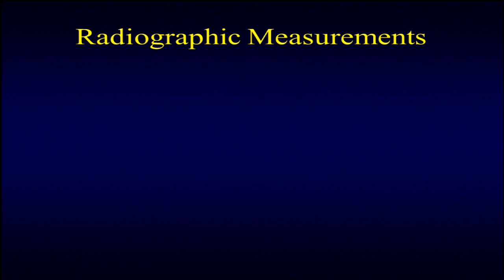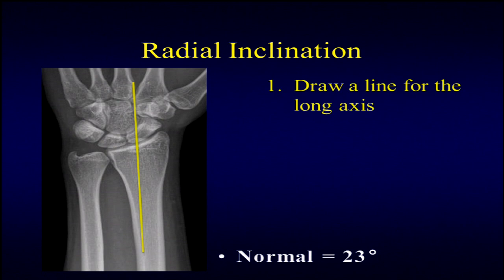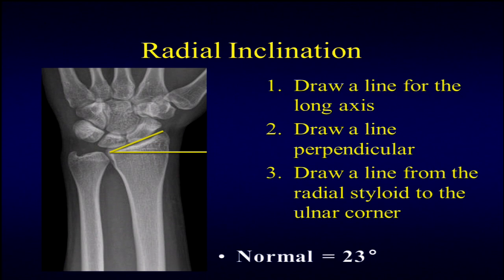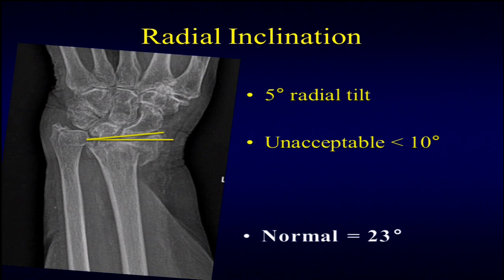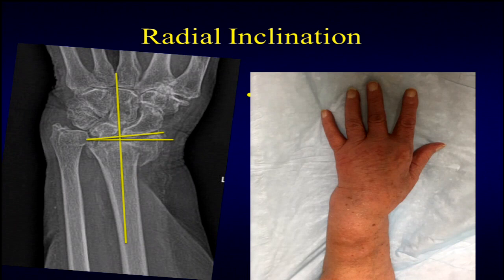Some of the standard radiographic measurements: for radial inclination, you drop a line down the long axis, draw a line perpendicular to that, then measure from the radial styloid to the ulnar aspect. Standardly this should be about 23 degrees. In this patient you can see they've lost most of their radial tilt—it's only about 5 degrees. There are numerous studies arguing how much a patient can tolerate, but I typically consider anything less than 10 degrees as operative.